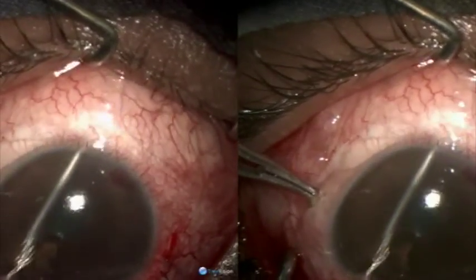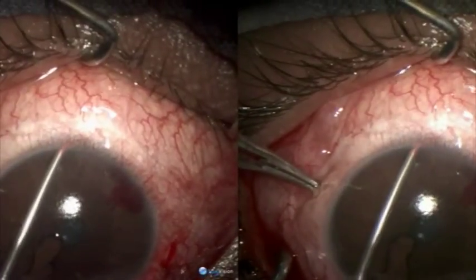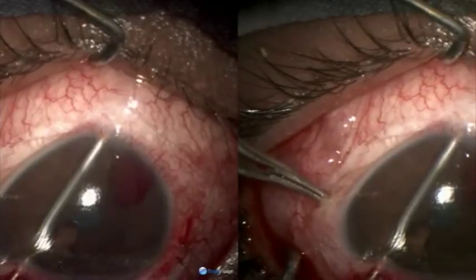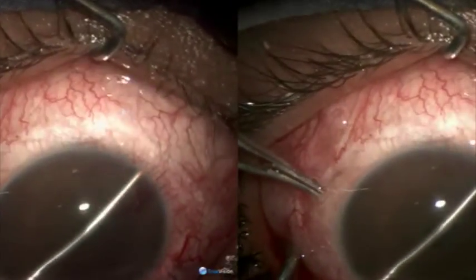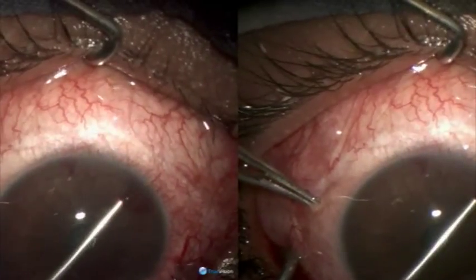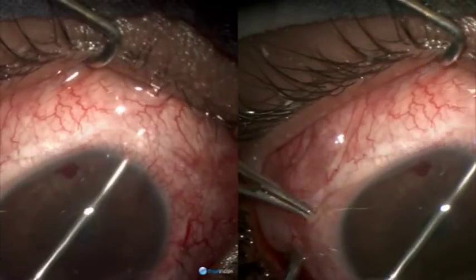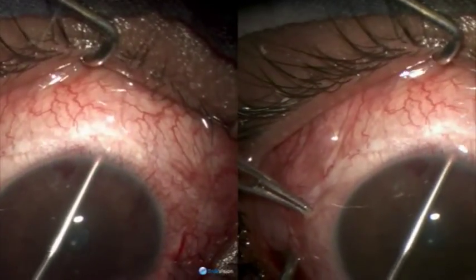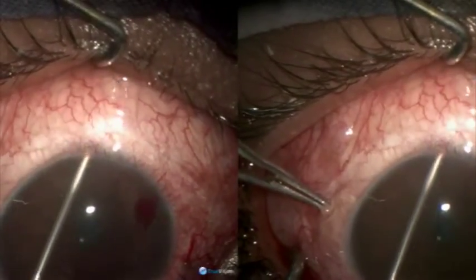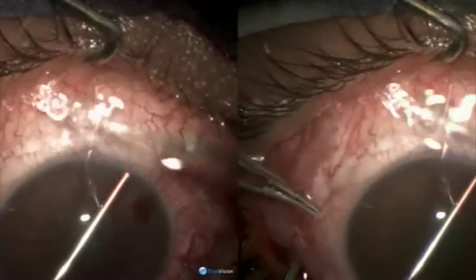It should go 4 to 5 millimeters beyond the limbus. You can see how it is pushing the sclera, so you can gauge the depth of cyclodialysis. It is preferable to have cyclodialysis which should cover about one-sixth of the circumference.